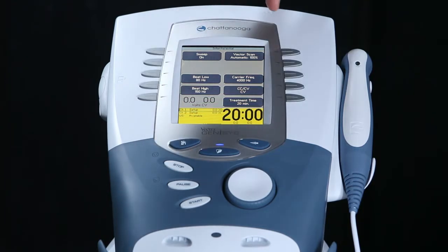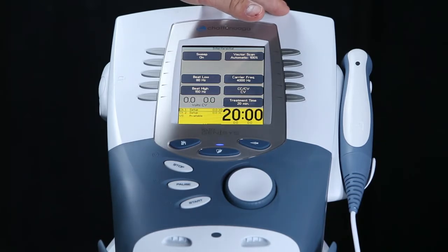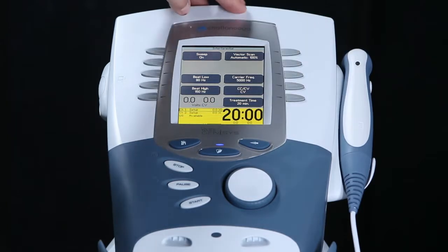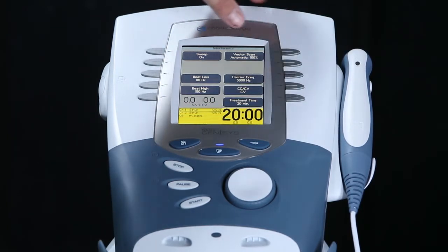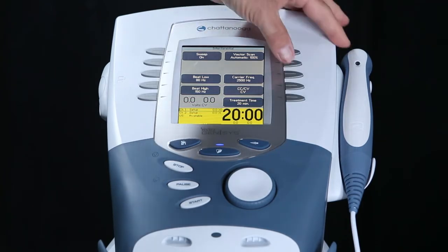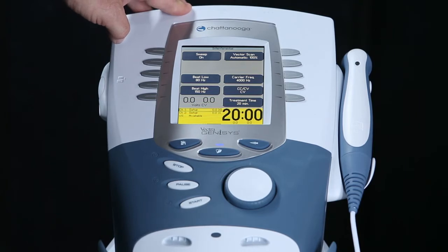The next thing that we have to adjust is the carrier frequency. 4,000 carrier frequency is typically used for a gate theory protocol. 5,000 would be used for a nerve block. 2,500 would be used for our opiate release. In this case, we're going to do the gate theory, so we're going to leave it at 4,000.